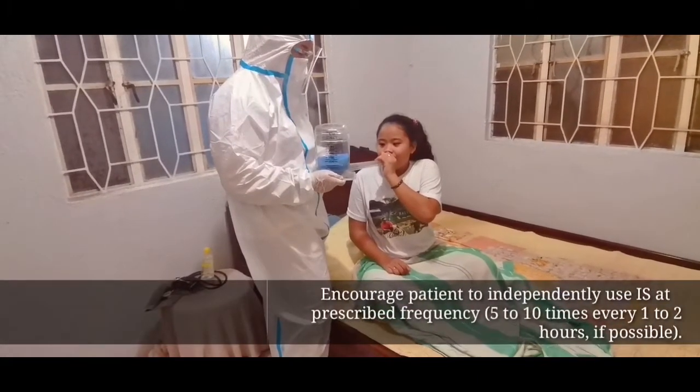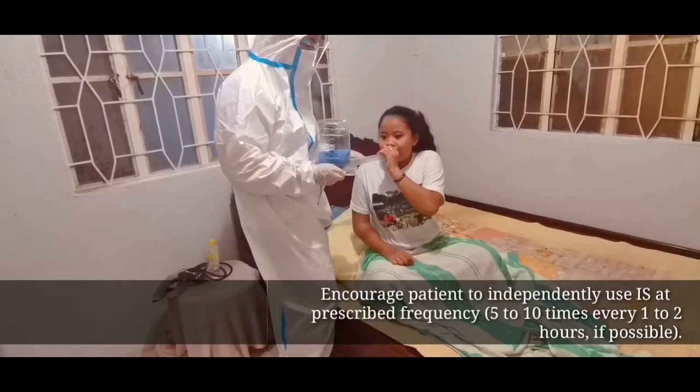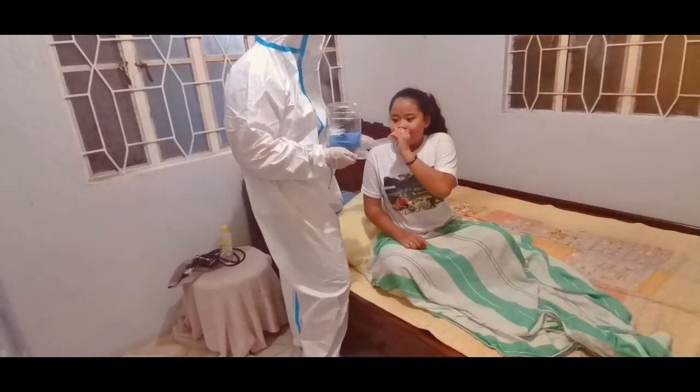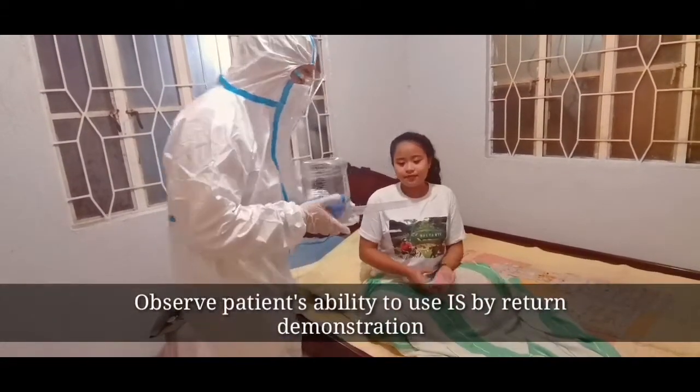Encourage the patient to independently use the incentive spirometer at the prescribed frequency, at least 5 to 10 times every 1 to 2 hours if possible. Observe the patient's ability to use the incentive spirometer by return demonstration.